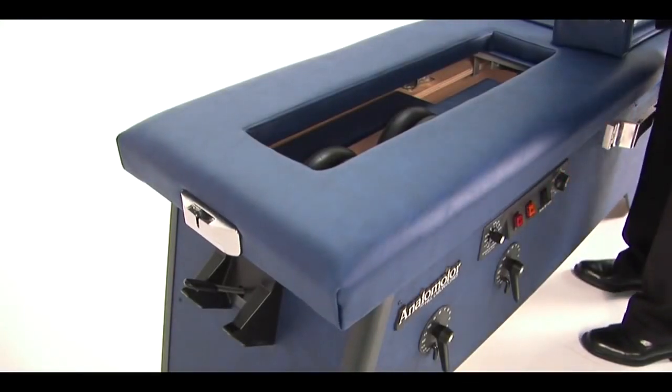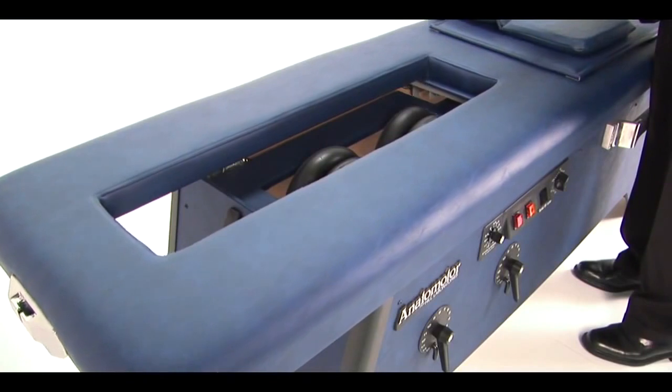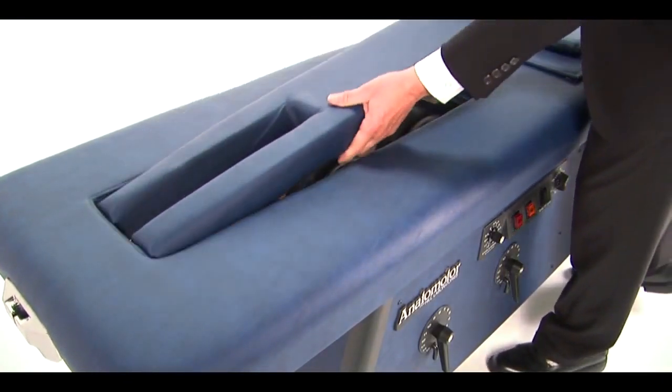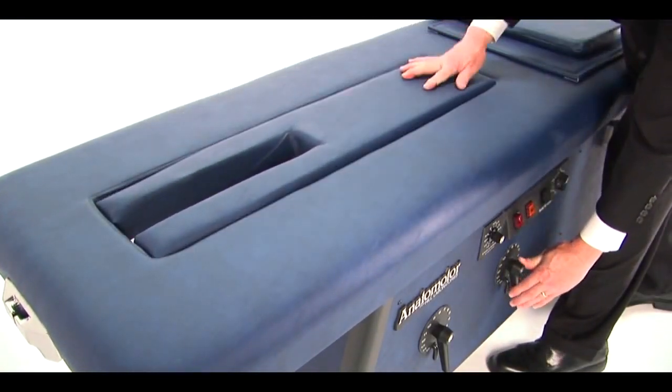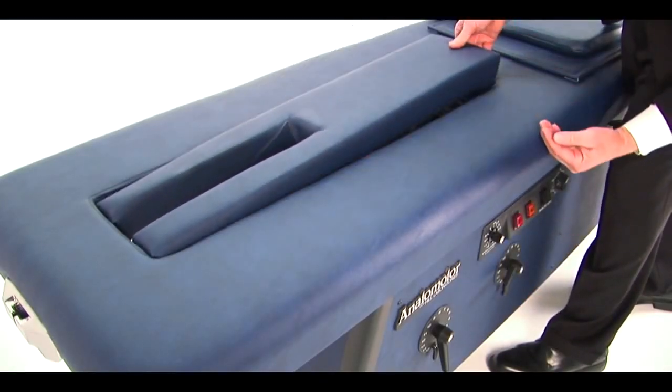To use the Anatomotor as a standalone treatment table, flip the switch to cervical and insert the filler block. The rollers can also be raised to create a loaded spring breakaway during manipulation.